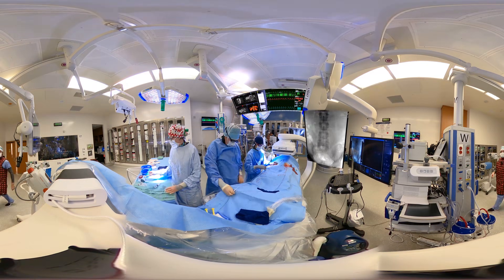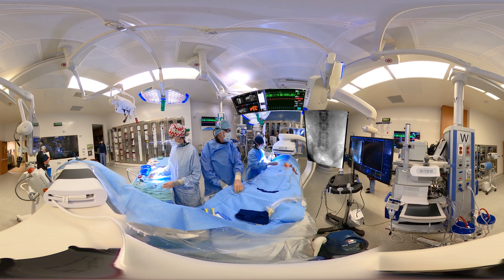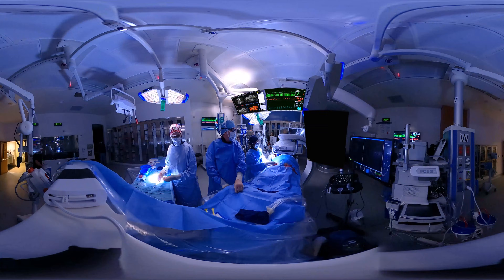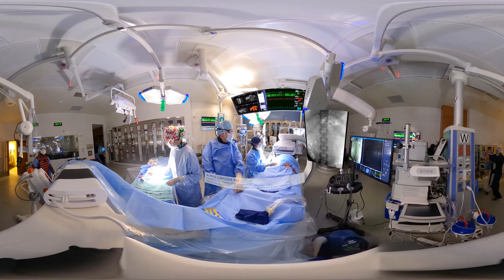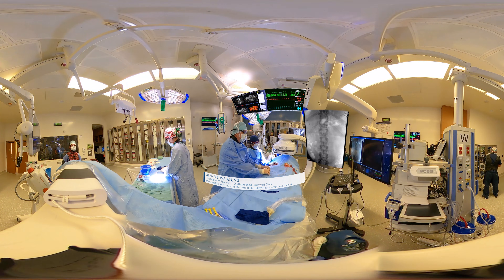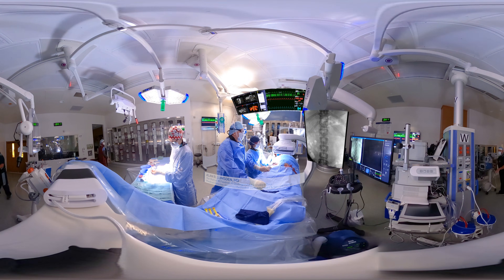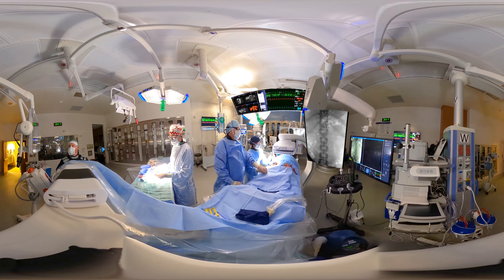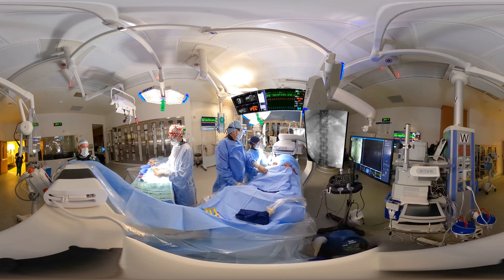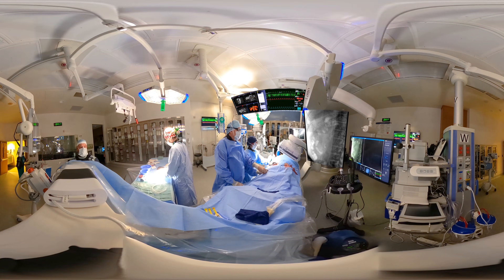What you can see here is us in the hybrid operating room. Since we're filming in 360, you have virtual vital signs displayed above us — that's a virtual screen. Looking to the right, this is actually a real screen. In this presentation, we choose to highlight this since you get a better picture of it. Now you can see the catheters are being passed up into the aorta.